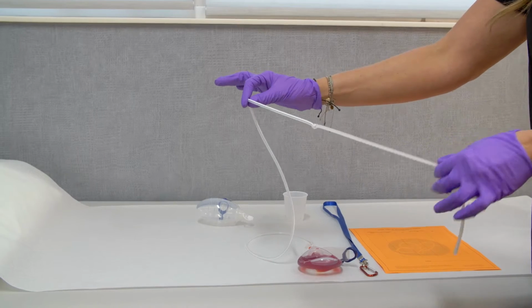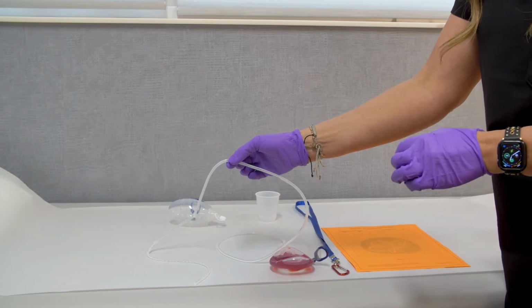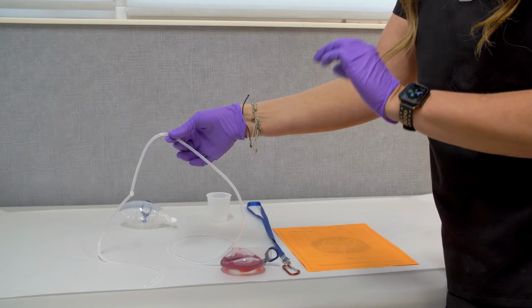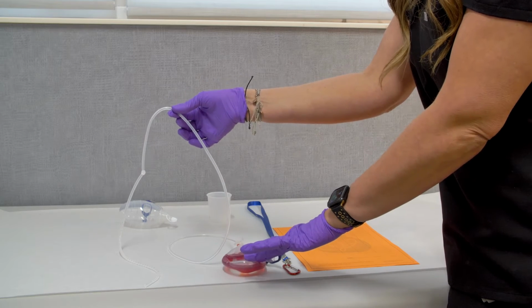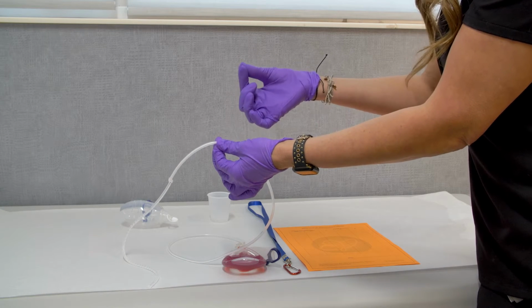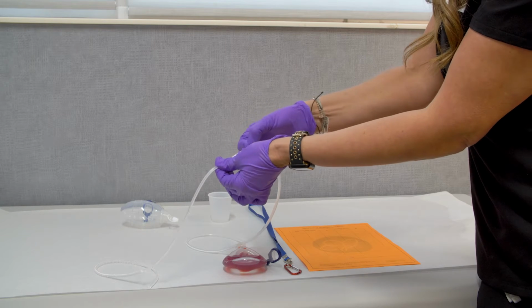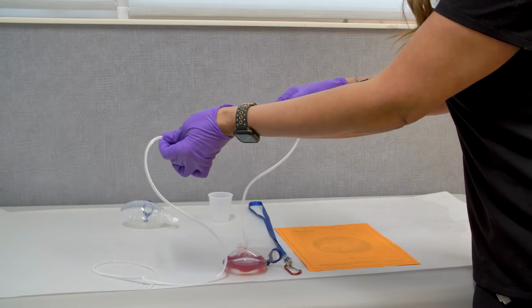This portion of the drain will be in the incision inside the body. What you're going to want to do prior to emptying the drain is what's called stripping of the drain. Sometimes you will notice in the tubing there will be darker areas, which are known as clots. These clots are okay, but we do want to make sure that we get that clot down the tubing and into the drain. You're going to take 2 fingers and pinch while you take your other 2 fingers and strip the drain. You're going to hold it tightly, release these 2 fingers, and continue to do that until you get the drainage or the thicker clot into the bulb.